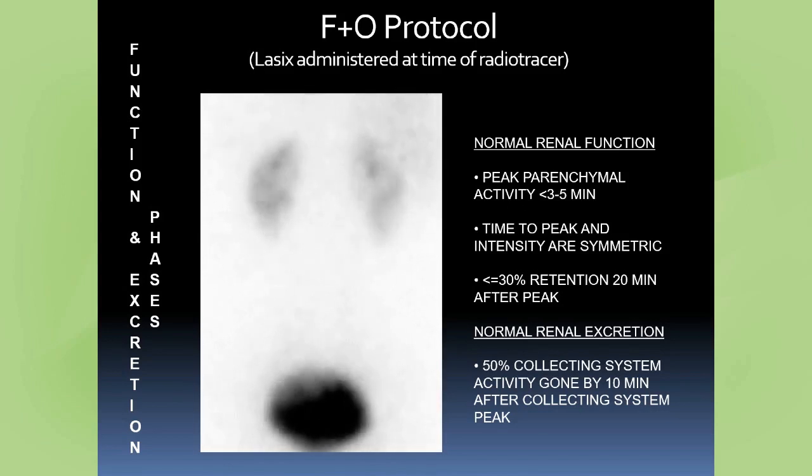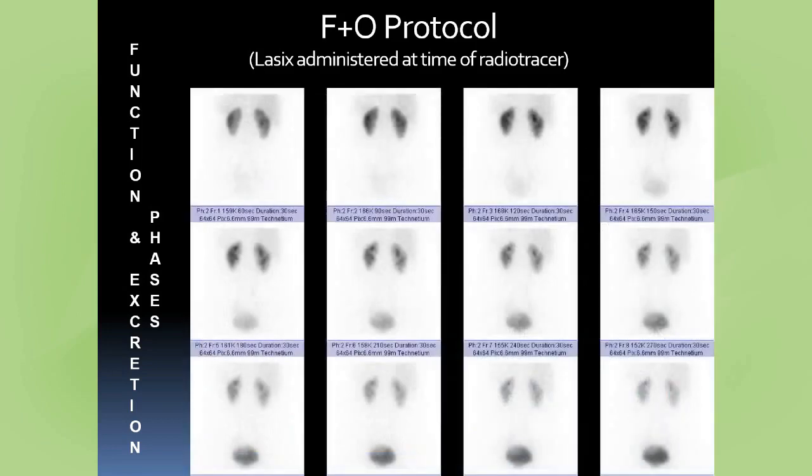So I understand that some people now reference all the way out to 15 minutes as an acceptable T1/2 time to call it normal. And again, I emphasize that this patient here is normal.